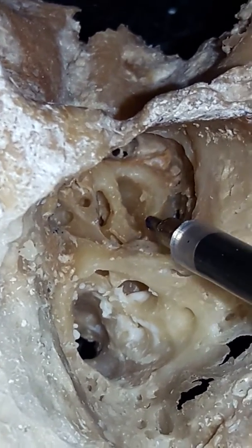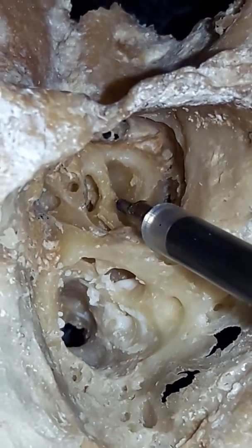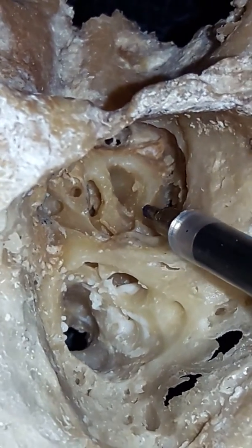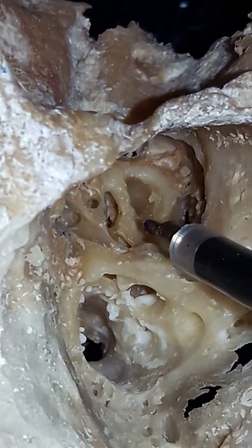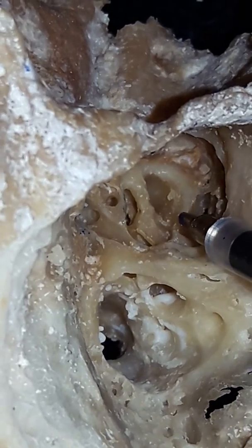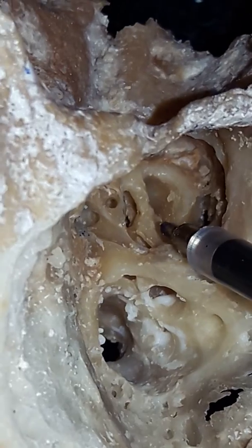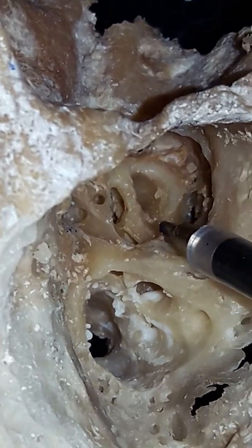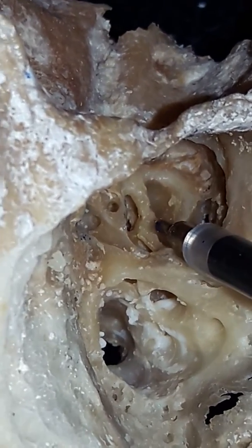The hook area consists of 3 parts: the proximal most basal part of the osseous-spiral lamella, the crista fenestrae and the crista semilunaris. Crista fenestrae is this thick part of the bone at the starting point of the basal turn of the cochlea. Crista semilunaris is a small ridge of bone at the base of the round window. Here this is the crista semilunaris.